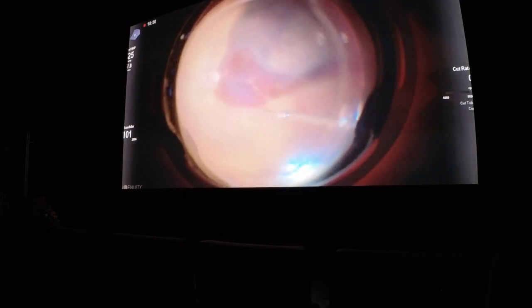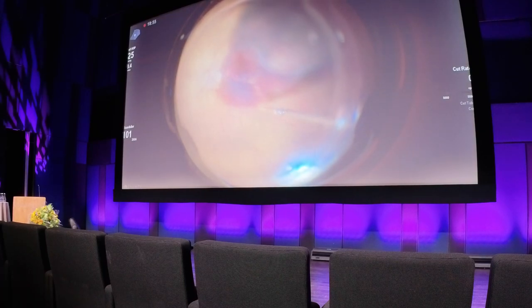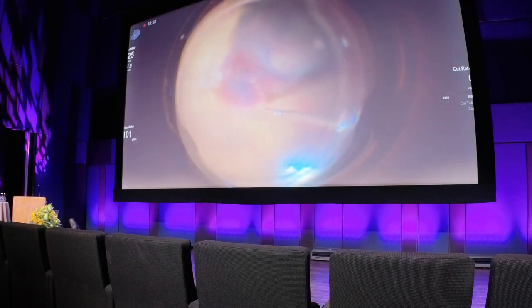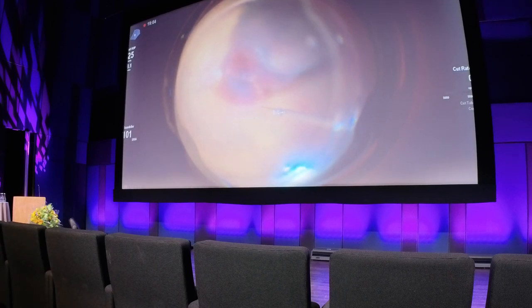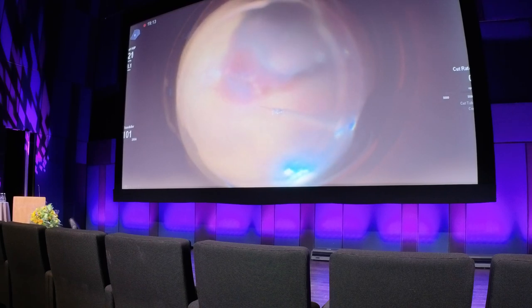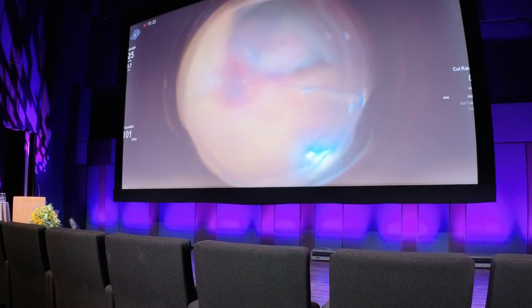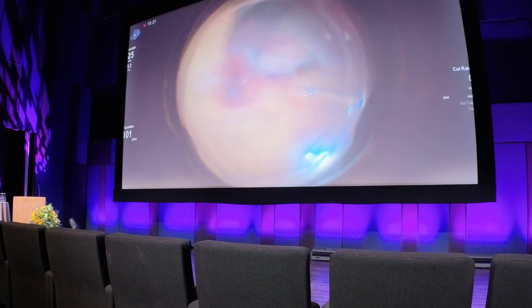This is a case of retinal arterial macroaneurysm in which we use subretinal TPA in order to dissolve and displace the subretinal hemorrhage. This is important because we know that there are medications like Luxturna which are for genetic diseases and are delivered subretinally. So better visualization with better control will provide us with more options to treat different eye conditions.